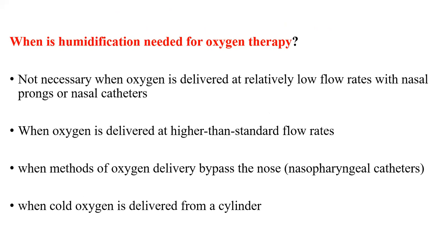Okay, when oxygen is delivered using a nasal prong, because it delivers low flow oxygen, you don't need humidification.